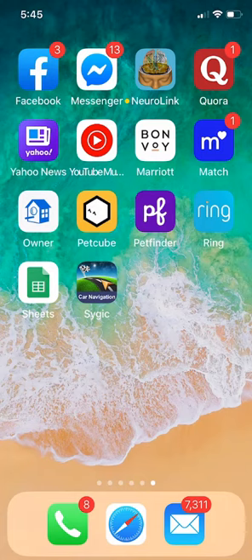This is a video of an app called the NeuroLink app. It's free and can be downloaded from the internet for smartphones such as the iPhone and Android. I'm just going to demonstrate it now.